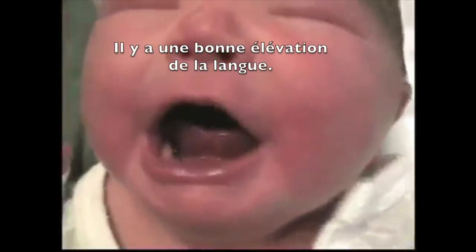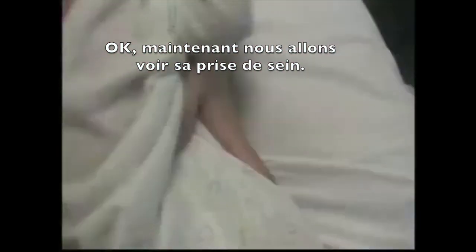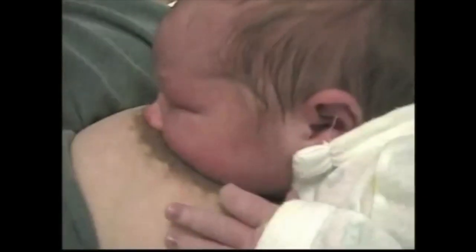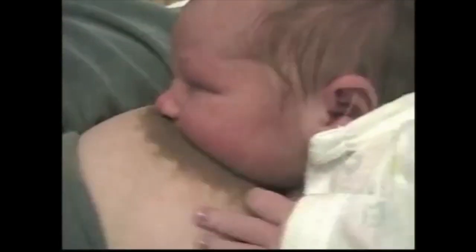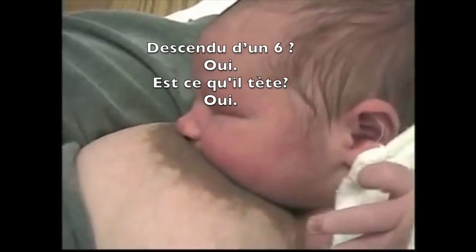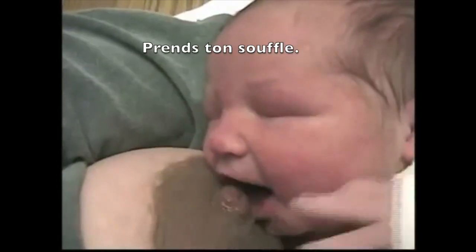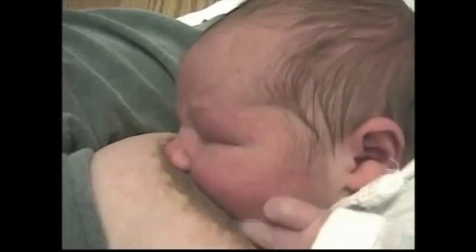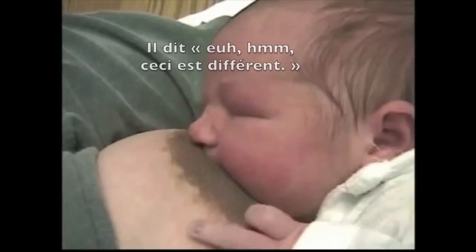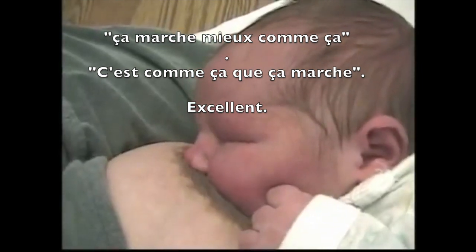There's a very nice lift to the tongue. Now we'll see how he latches. Wow — does that feel a lot more comfortable? That's like a one, down from a six. Is he sucking? Good. It works better now — my tongue works.